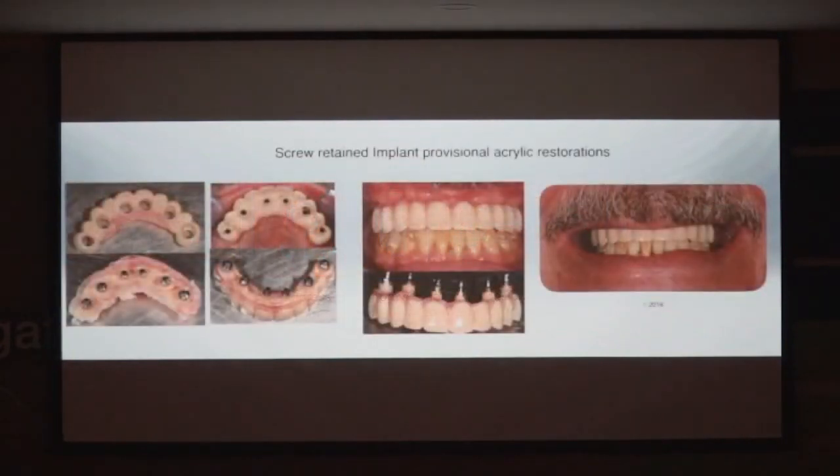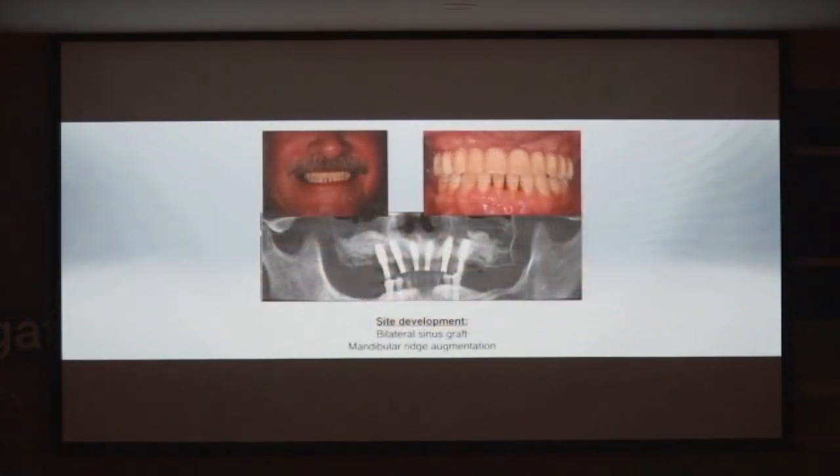So the acrylic provisional is made. And so then I do bilateral sinus lifts. Okay? Again, this was before I had the X-guide. And now X-guide's becoming available while these are maturing. And so the rest of these implants are going to be placed guided. But I have a fixed hybrid restoration on the maxilla.